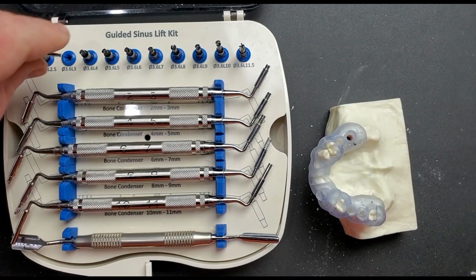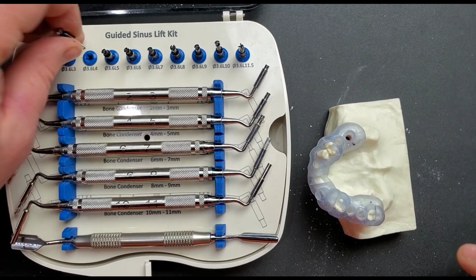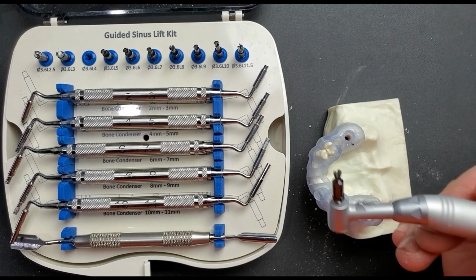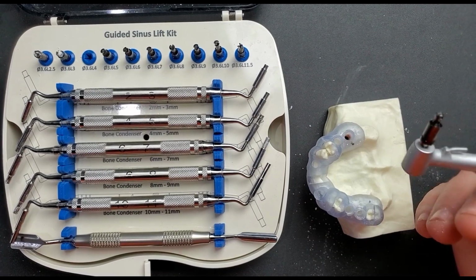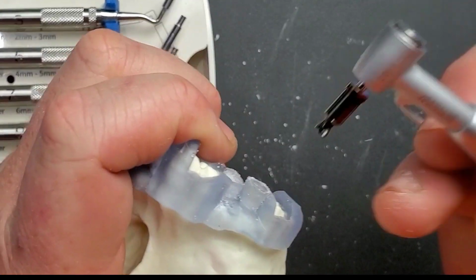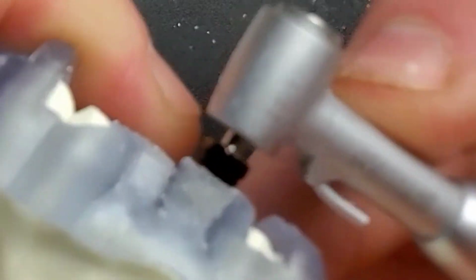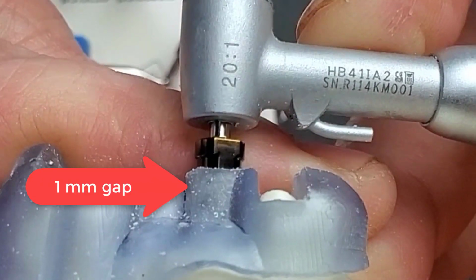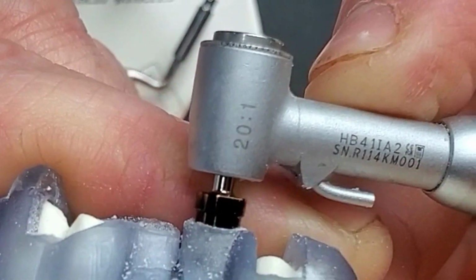And I do know, since I've got 8 millimeters of height, that I'm not anywhere near the sinus, but I'll show you how you tell when you've breached the sinus floor. The best way to do that, where you don't have to rely on tactile sensation or visualizing the membrane, is to just take the next length of drill and introduce it into the site without it running. And when you seat that all the way down, if there is still a gap between the stop and the guide, then you know that you've still got bone ahead of you.